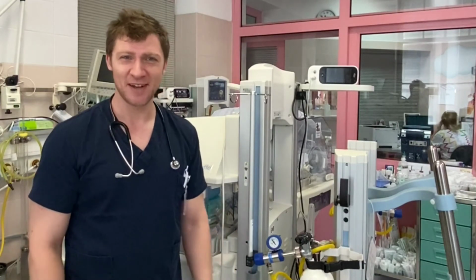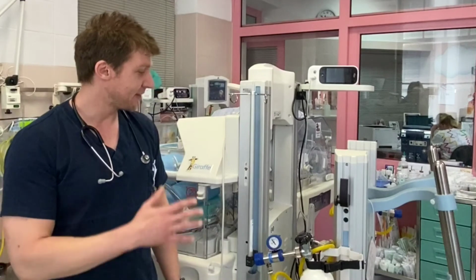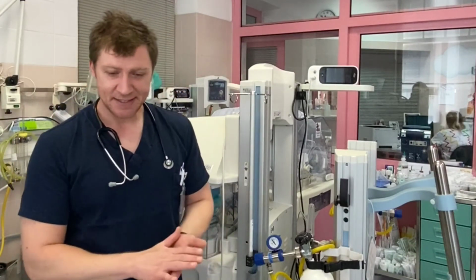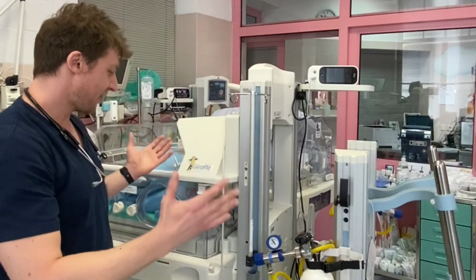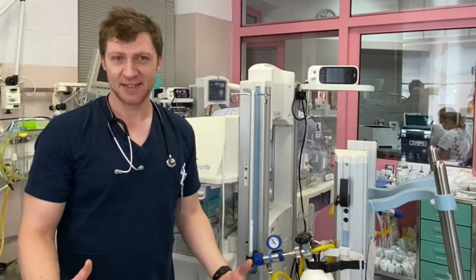What we also have here is the GE Star resuscitator, which you also bought for us, and we thank you for that. That resuscitator is something we use every day because we take care of complicated pregnancies. That machine opens up the lungs and enables the baby, who is breathing spontaneously, to continue breathing spontaneously, and we can provide non-invasive ventilation. It also carries the vital function monitor with it, so it's a kind of complete intensive care bed, which is mobile.